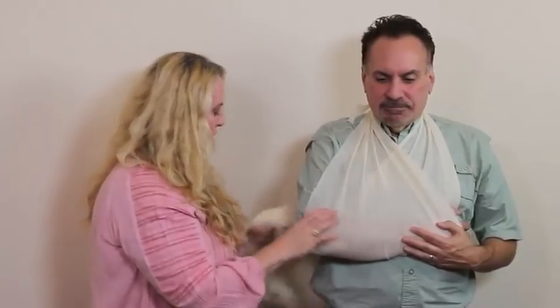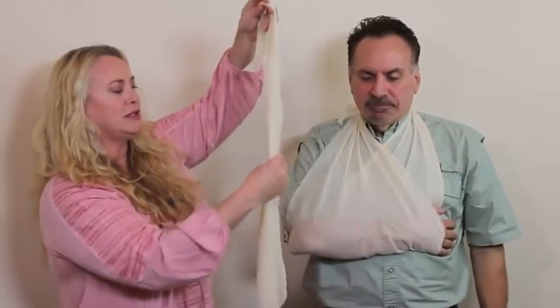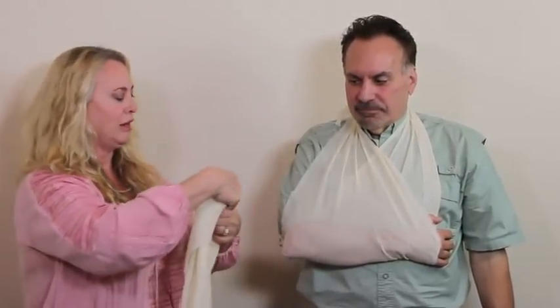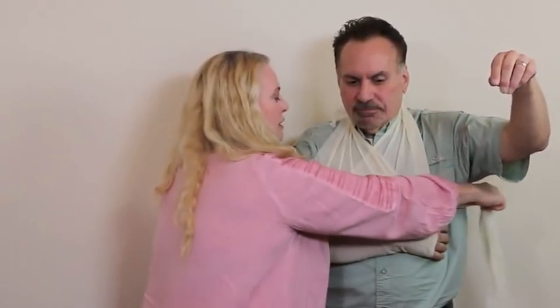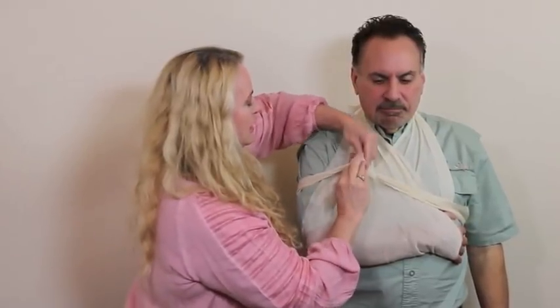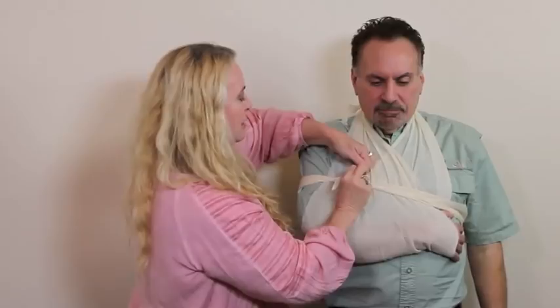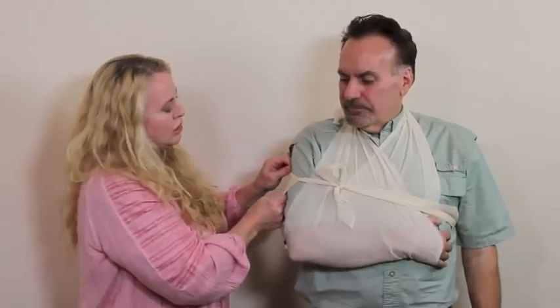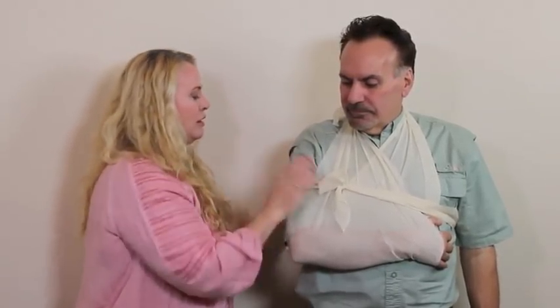For extra stabilization, use an additional triangular bandage — about two to three inches wide, not too twisted or narrow — and wrap it across the chest (not over the injured arm), then secure with a double knot so the arm cannot swing away from the body if the person needs to move. Make sure it's not too tight and not cutting into the arm.